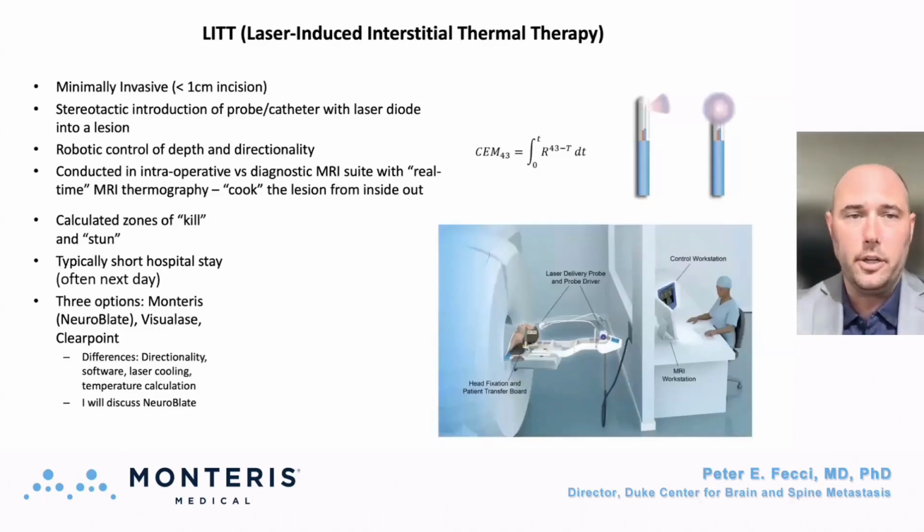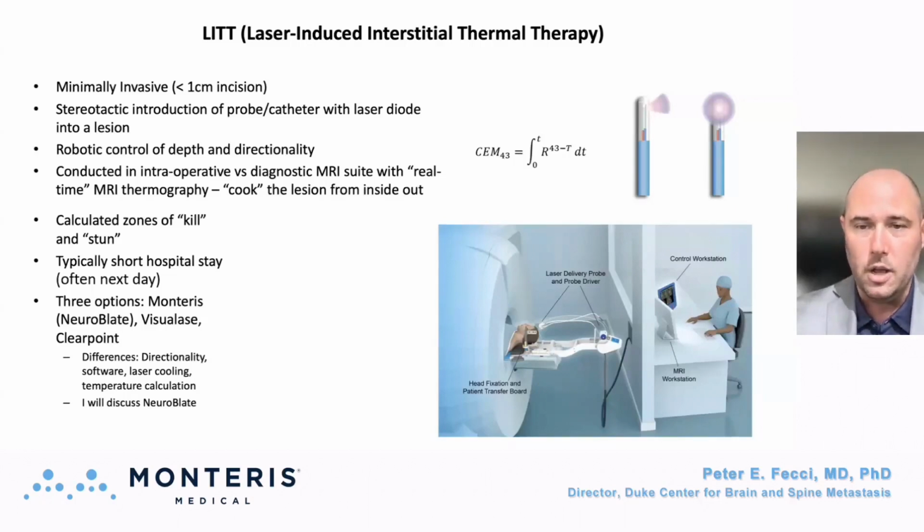A little bit more detail here. LITT, of course, stands for laser-induced interstitial thermal therapy. Many people will just say laser interstitial thermal therapy. This is a minimally invasive surgical procedure. It's important to stress that this is a surgical procedure. It is an alternative to open craniotomy. It is not an alternative to other things like radiation, which is often used in conjunction with, much like one would use resection in conjunction with radiation.